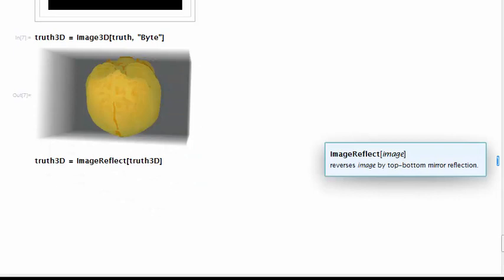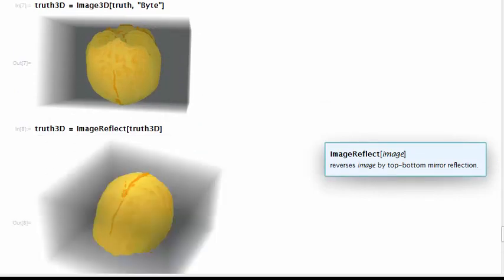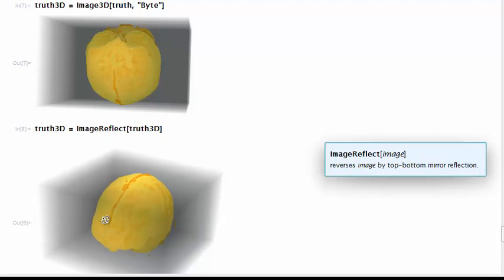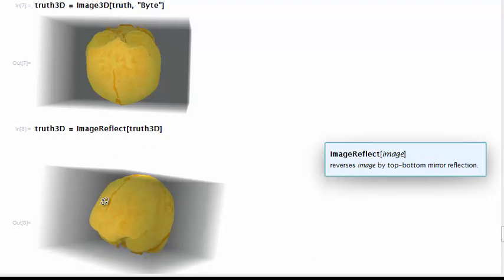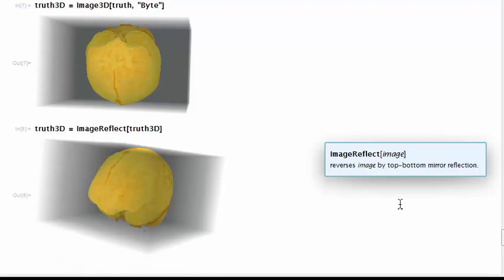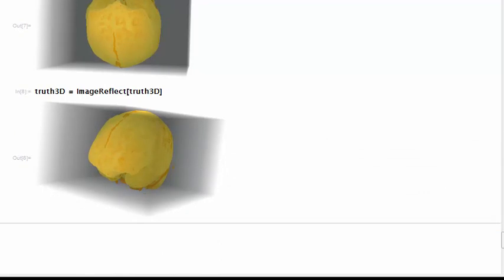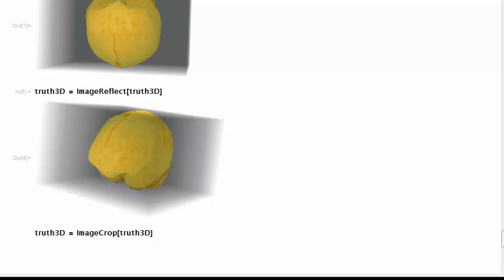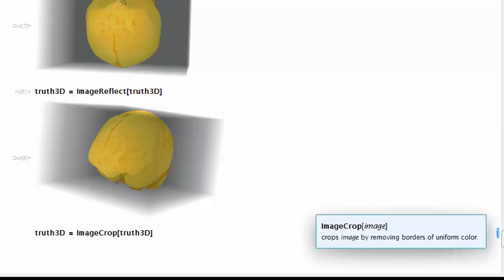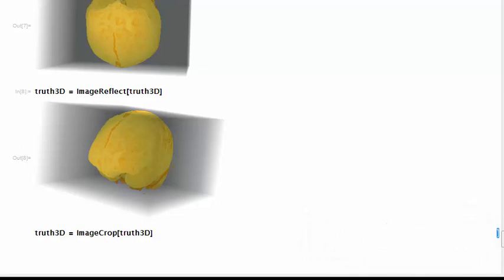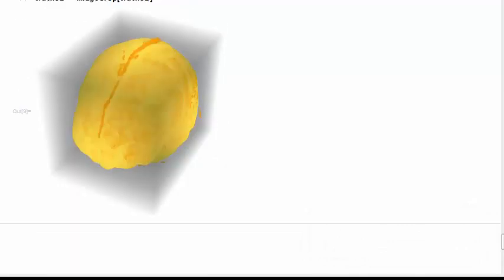You can see that it gives us the brain volume in its natural alignment. However, there's still an artifact, a wasteful artifact in the image. This is all this gray empty space that surrounds the brain. It occupies memory. We can eliminate it using ImageCrop. Now we have a more economical representation of the same data.